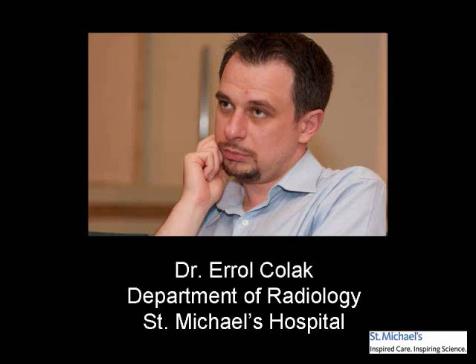I'd like to introduce Dr. Errol Colak, who is a consultant in radiology at St. Michael's Hospital. He's going to go over some of the interesting elements in this X-ray and in this clinical presentation.